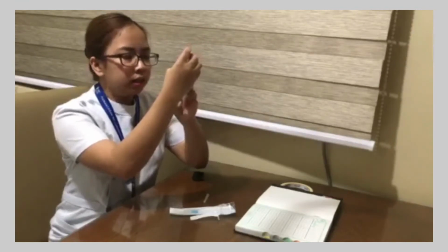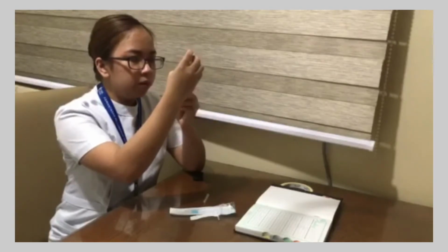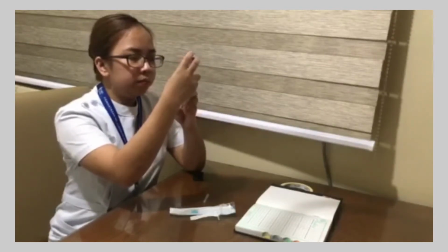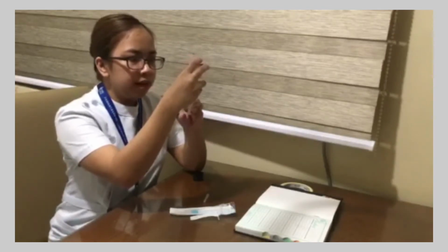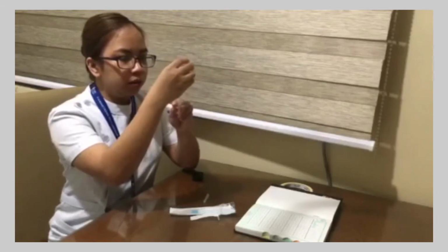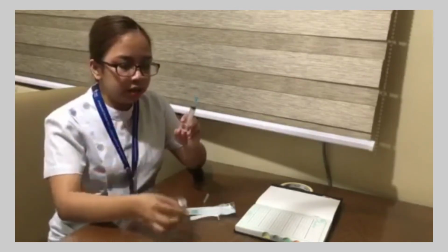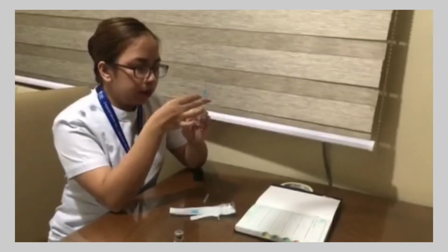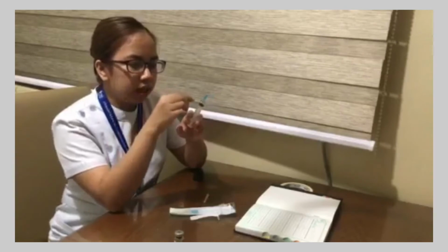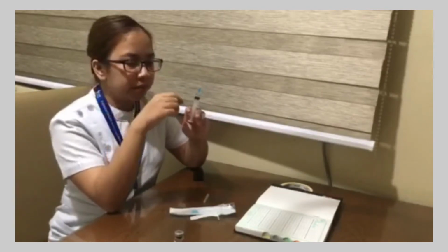So I can eject the bubble from the syringe back into the vial. After that, I'm going to remove the syringe from the vial and flick the syringe to remove the air bubbles. The air bubbles will rise to the top of the needle and can be ejected, still using the upright position.